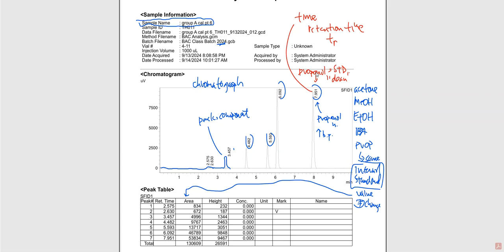Up next, we've got all of these other things in there. Methanol is in there. Ethanol is in there. Isopropyl alcohol is in there. We can do data on every single one of these. That is not a problem. We can, and we probably will build calibration curves just for the fun of it. But really what we're after is blood alcohol concentration.